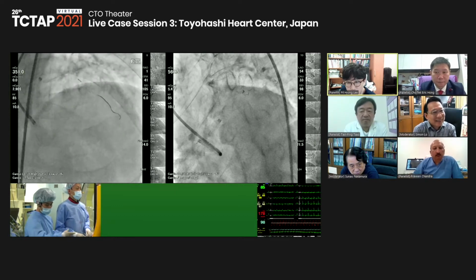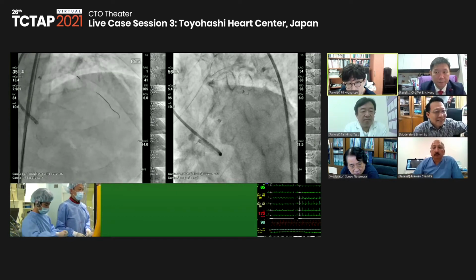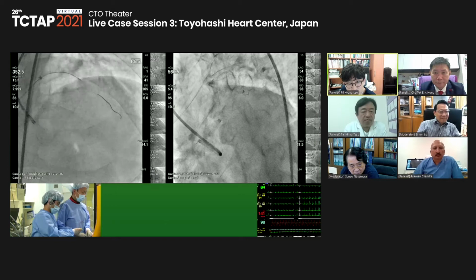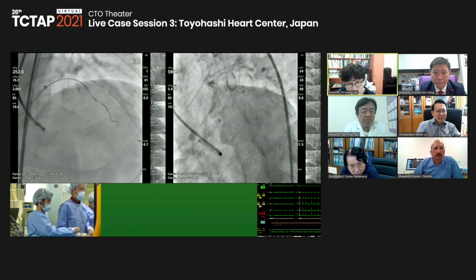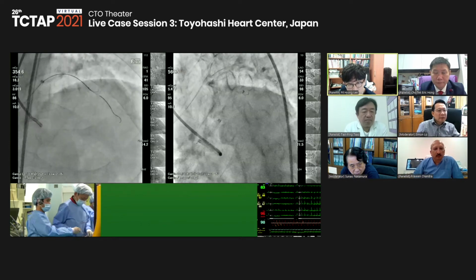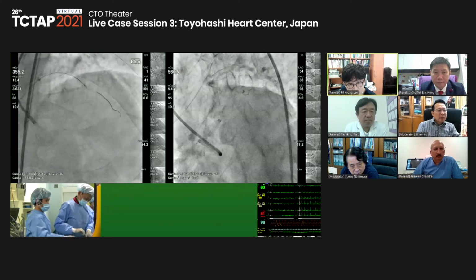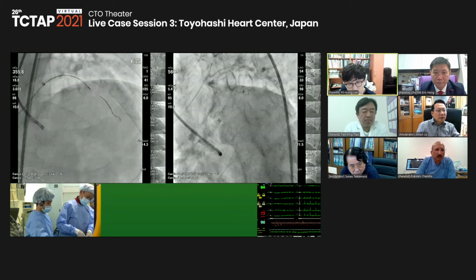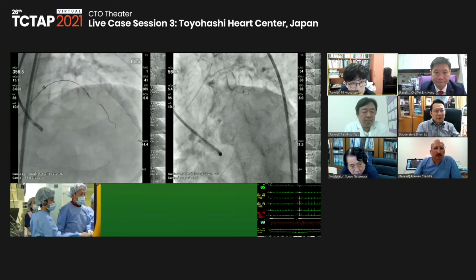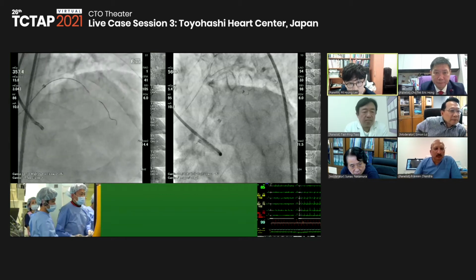But if it was me, we could have a try for some minutes tackling this micro channel, and if it doesn't work, and you have a good interventional retrograde channel, then the retrograde will work quite easily. So that's one option for a quick turnover.